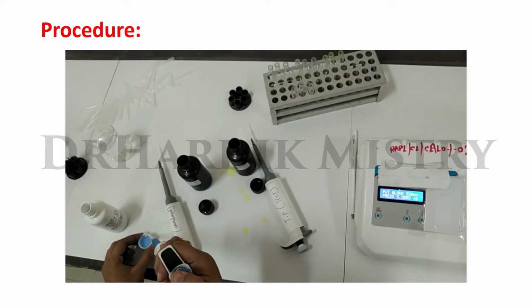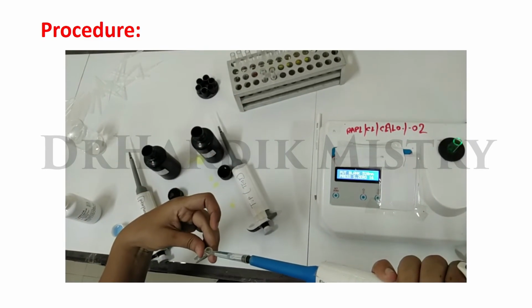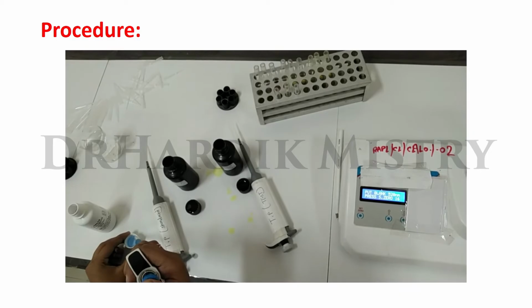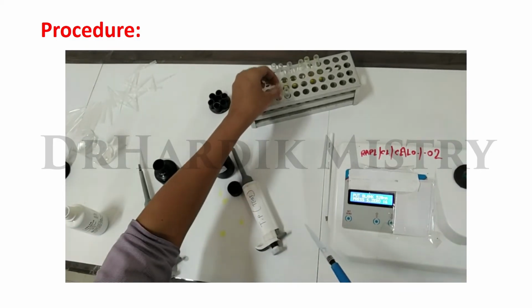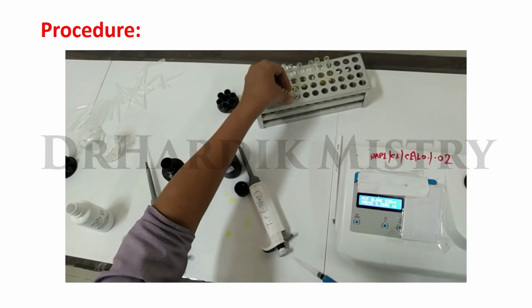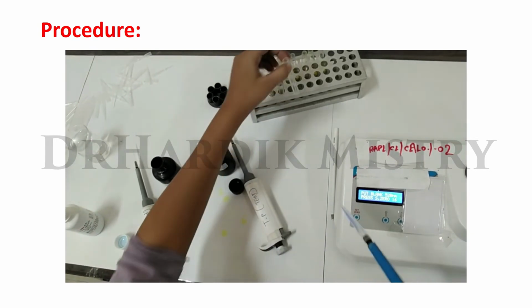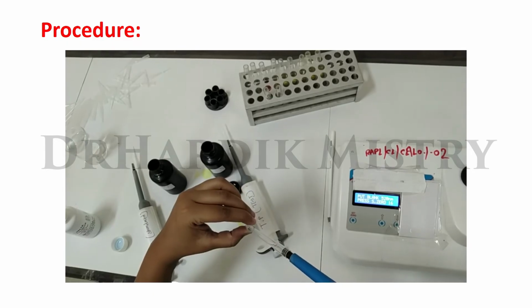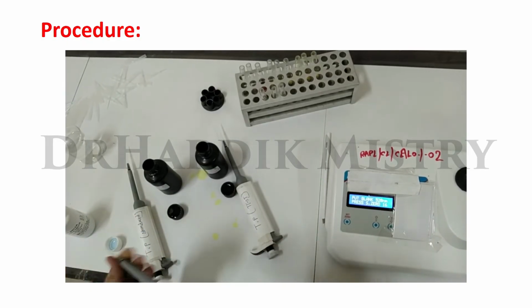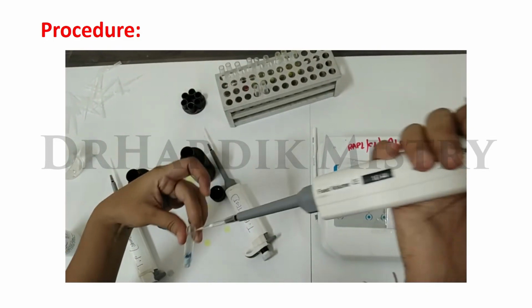Now the procedure part. Take 3 test tubes. Label the test tubes B for blank, S for standard, T for test. Now add 1 ml of Biuret reagent in all 3 test tubes. Add 10 microliter of distilled water in the blank test tube.